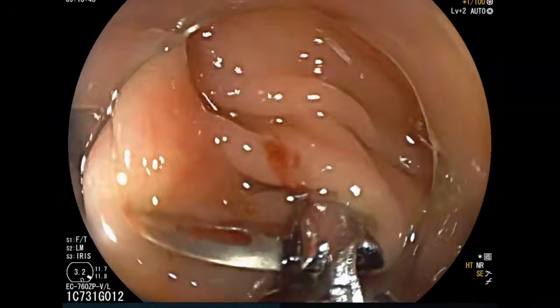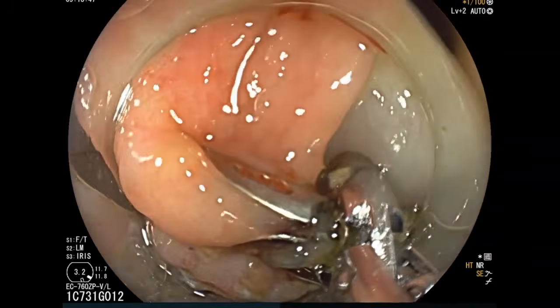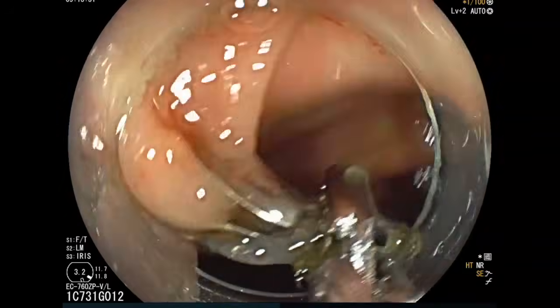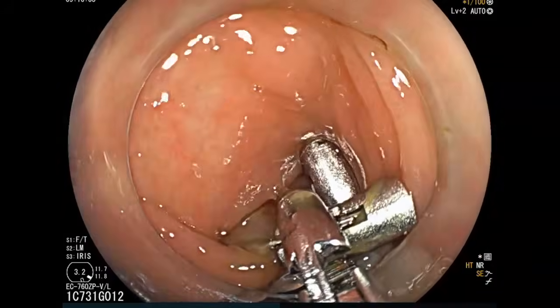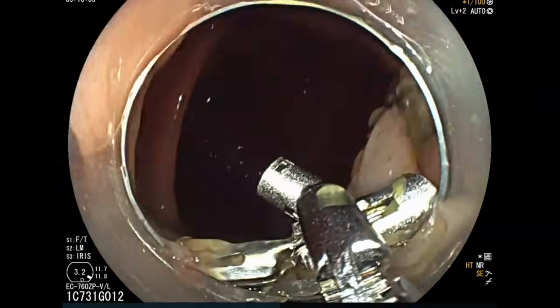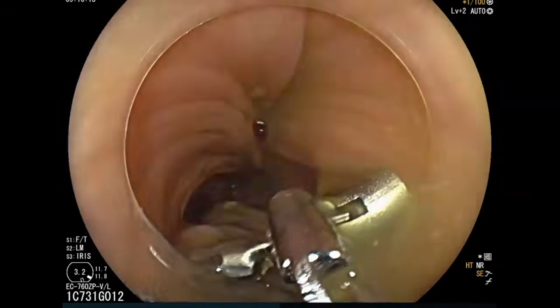Removal of traction points can be achieved using a grasping forceps by removing the contralateral clip one at a time and then dragging the lesion, or by using scissors to cut the rubber band in one traction point and pull up the lesion with grasping forceps, grabbing the second clip.